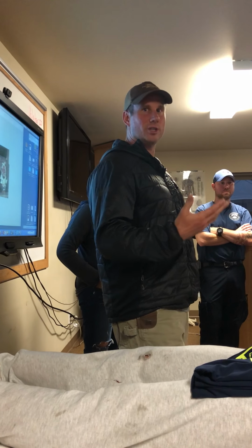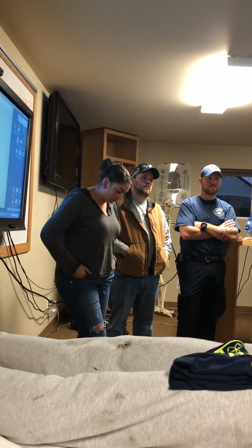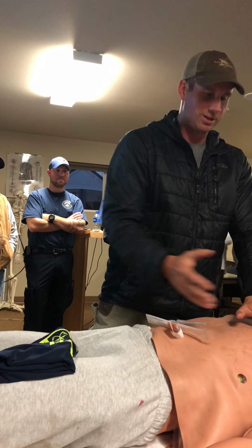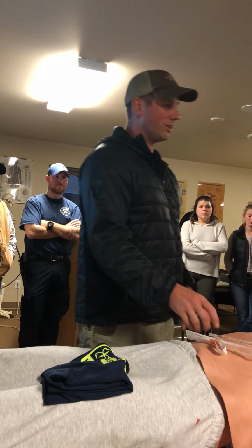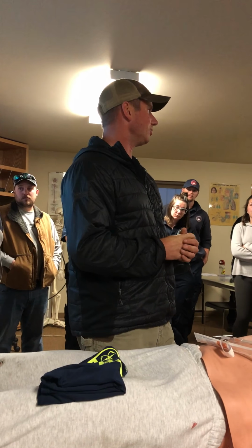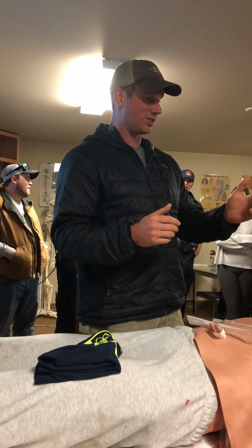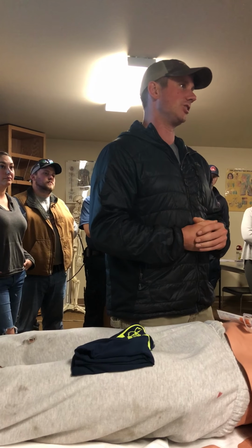you're not really circulating much blood, because you're doing compressions, there's increased pressure, and then the recoil. We're really focusing on recoil with our high performance CPR. If you recoil and there's no blood to return, you're not getting effective CPR. That being said, there are some patients who may respond to some of these efforts, and the way I would do it, I would get someone on there trying to get access, another person would be compressing the chest, and someone else would be decompressing, and then I would manage the airway.